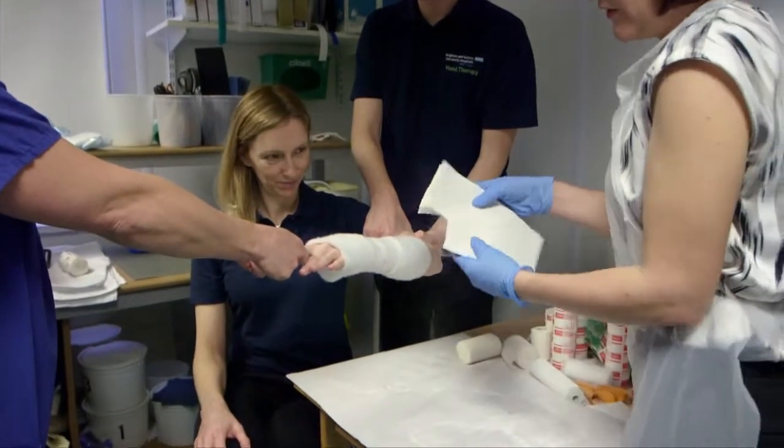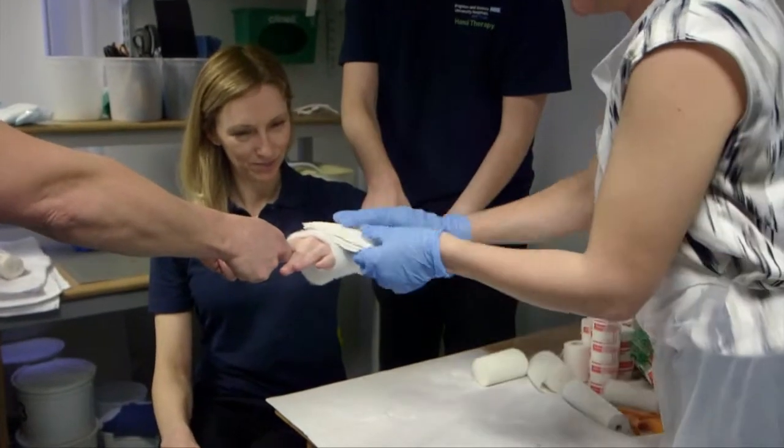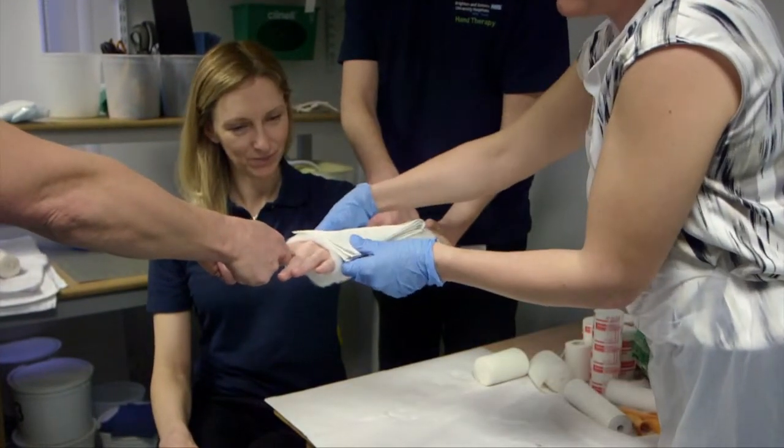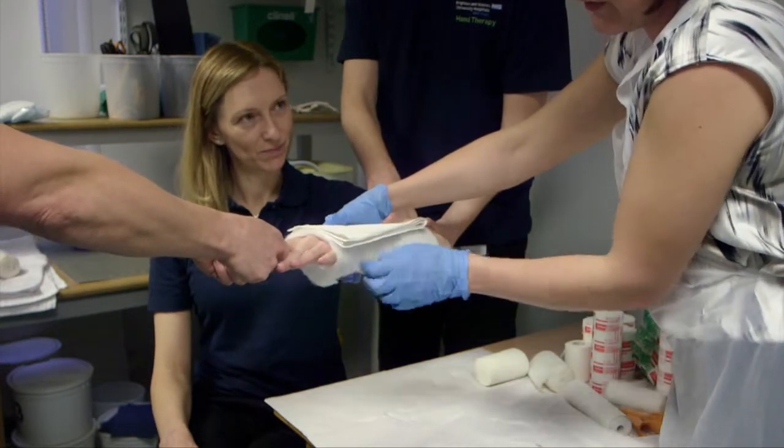The easiest way to get three-point moulding is to cut a corner out of the back slab so that when it is applied it wraps around the volar aspect of the radius. You must always leave a free section to allow for swelling.